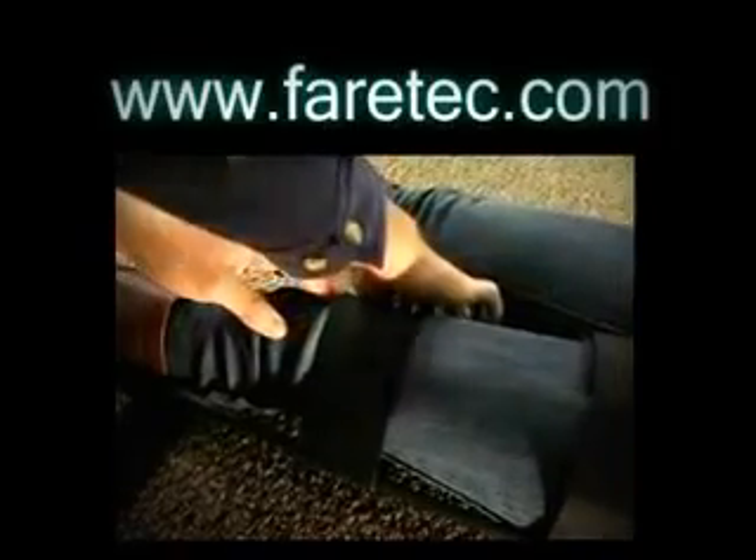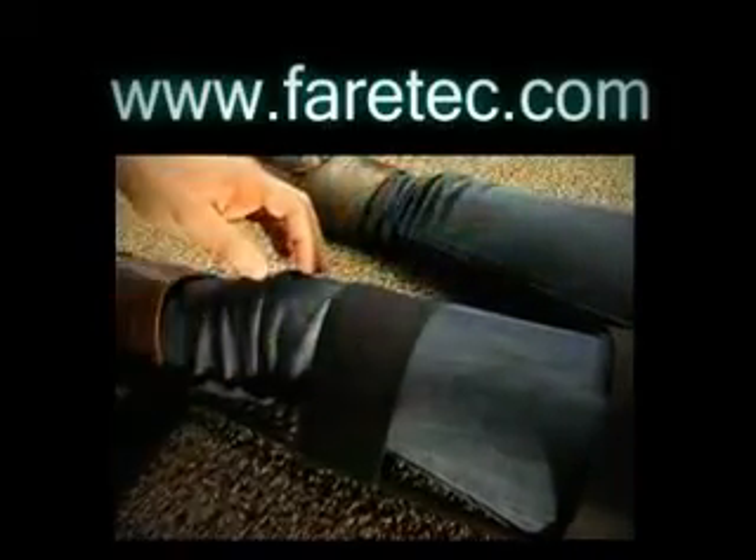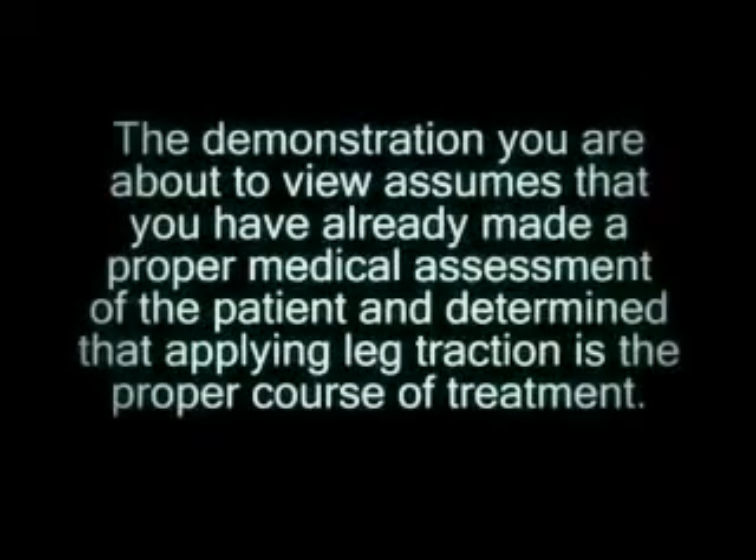Contact us at www.faretec.com for further information and support. The demonstration you are about to view assumes that you have already made a proper medical assessment of the patient and determined that applying leg traction is the proper course of treatment.